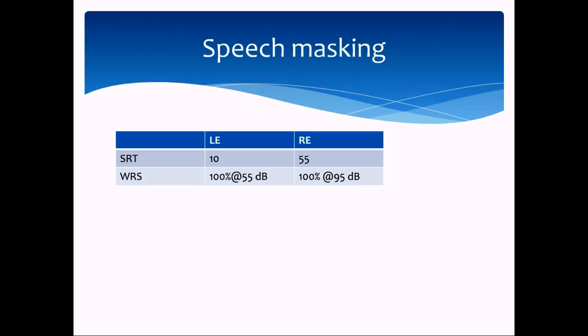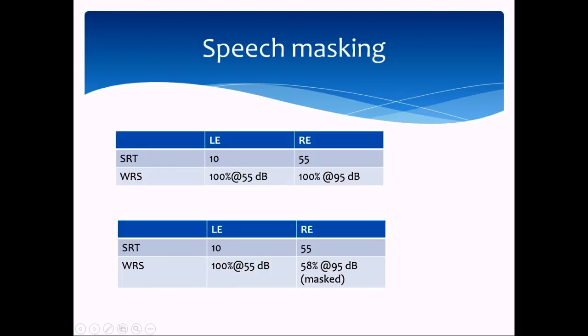However, if these were your masked bone conduction results, then what you have is a conductive hearing loss in the low frequencies, and then you're looking more at an eardrum problem or potentially fluid in the middle ear space, so an otitis media type of problem. And this is absolutely a very common audiogram for young children that might have an ear infection. So this conductive low frequency hearing loss is actually much more common. Conductive hearing losses by their nature are typically low frequency. So this is a much different audiogram, and it's really only the masked bone that changed from this to the potential Meniere's disease. It can also make a huge difference in speech masking.